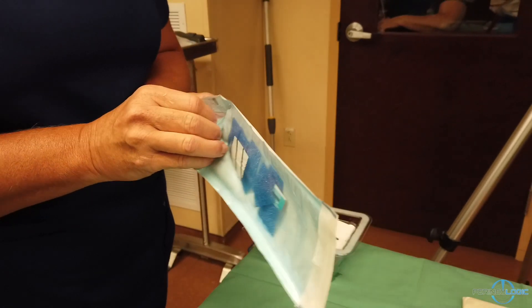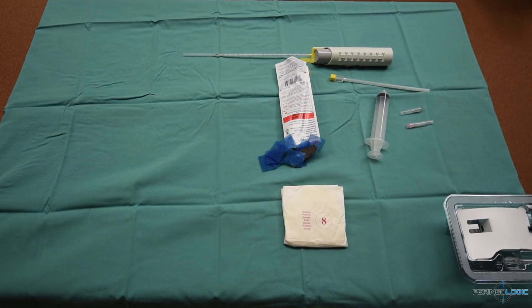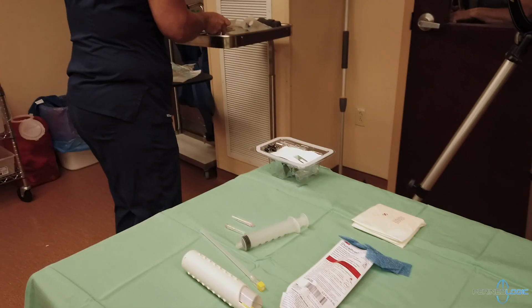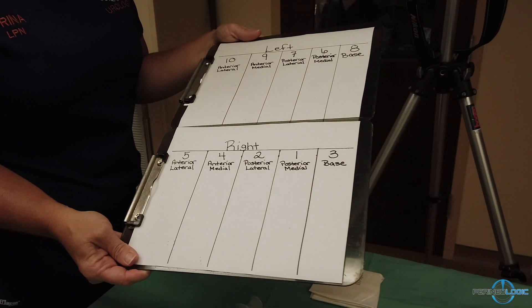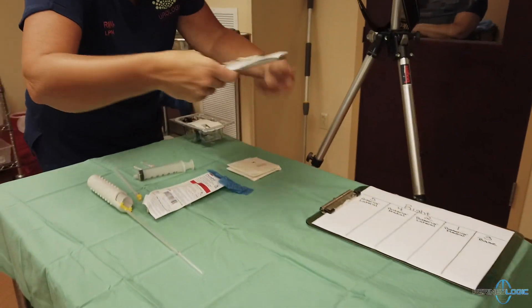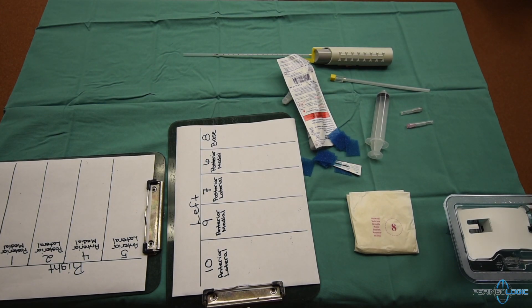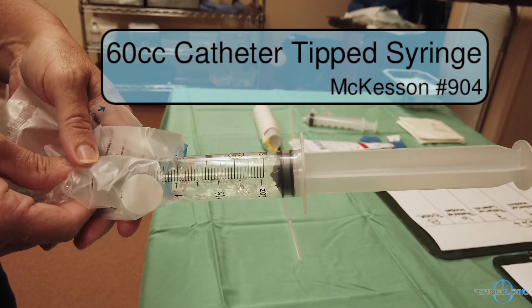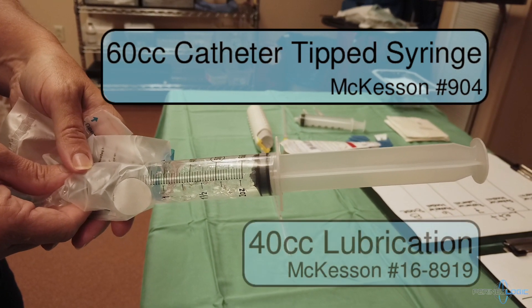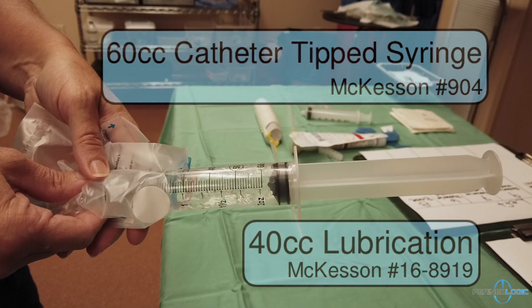We use these little blue sterile sponges to place the biopsy cores upon once they have been taken. We also use 2 clipboards to place the sponges on to keep track of the sector which is being sampled. A 60cc catheter tip syringe is loaded with 40cc of lubrication to assist the ultrasound probe with entering the rectum.